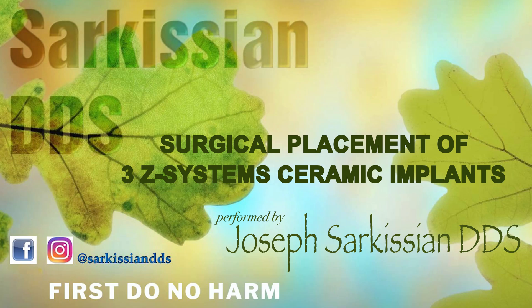Hi, this is Dr. Joseph Sarkissian. In this video I will present a series of three zirconia implants being placed in an older gentleman. My implants of choice here are the amazingly versatile Swiss manufactured Z-Systems zirconia implants.